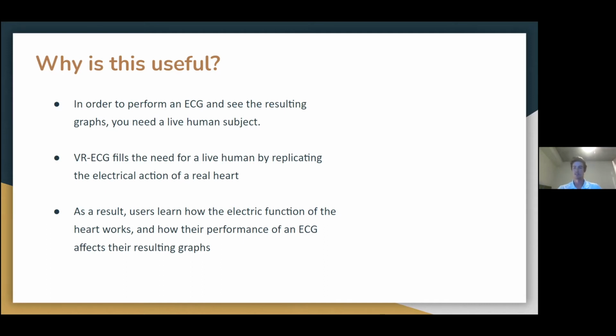So whether that's yourself or another person, or you're in a medical class and you've got to have one person volunteer from the class and take their shirt off and lay down on the bed, and then you place all of the leads on them, and that way you can actually see printed out on a piece of paper or on a monitor the actual results of the EKG.